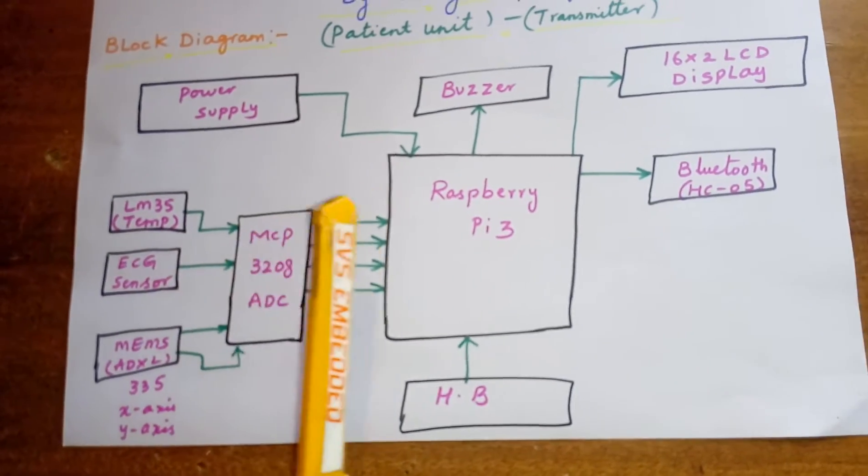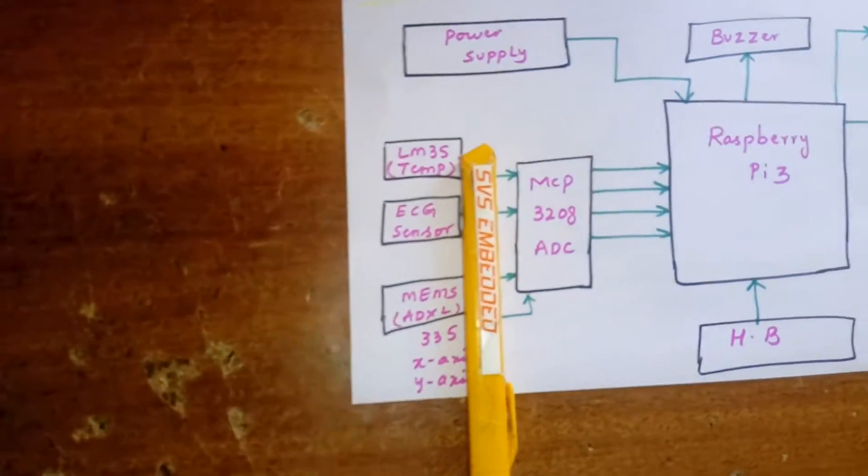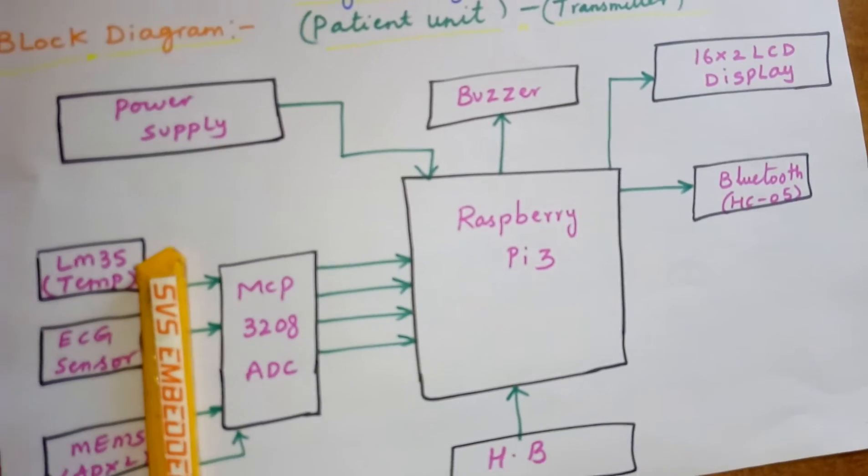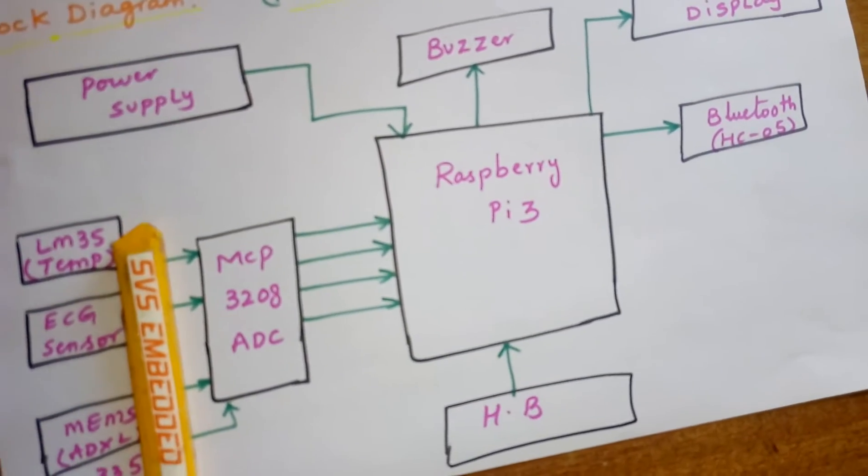These are analog sensors and this is a digital sensor. Whatever analog sensor data is coming will be displayed on the LCD. We are going to trigger the buzzer if anything happens, and that data should be displayed on the LCD. We are going to display data onto the LabVIEW.